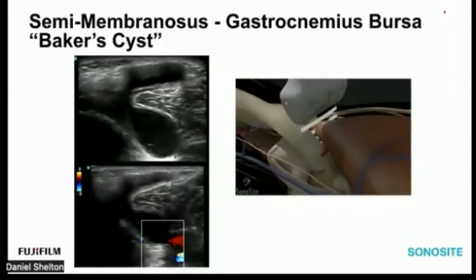And that's because the fluid is relatively enhancing the tissues underneath it, like scanning through a bladder. So if you're scanning through a bladder in the pelvis, you'll notice that the fluid collection of the bladder basically amplifies the sound waves that are underneath the bladder. And that's the same thing that's happening here. So if we have a big, bright, hyperechoic undersurface or deep surface to the Baker's cyst, it's compressible, you could chase that with the needle and aspirate that, no problem.